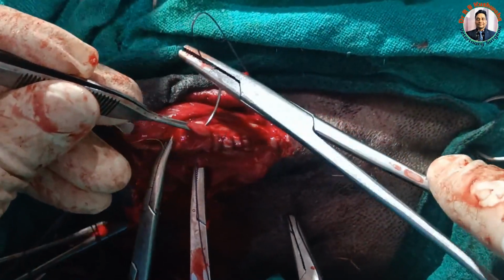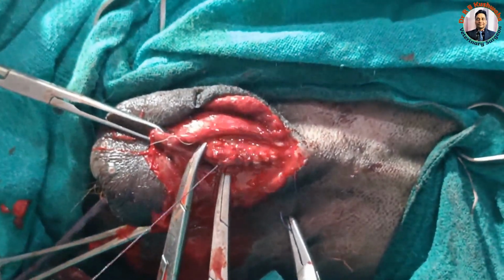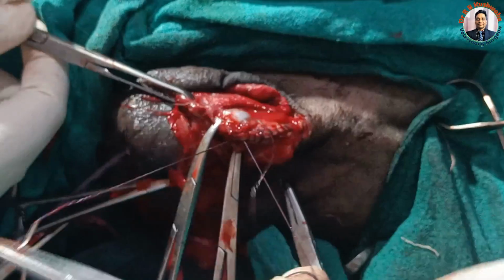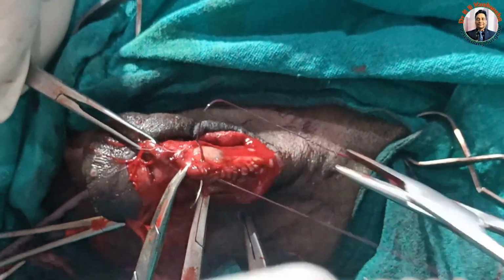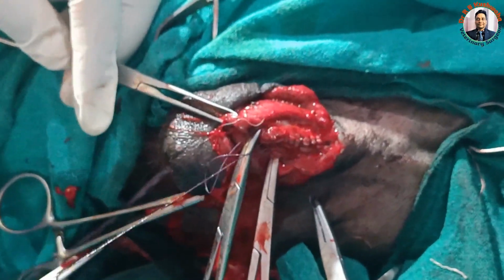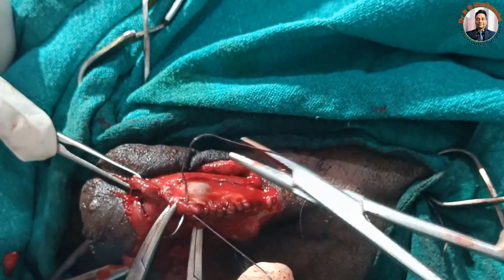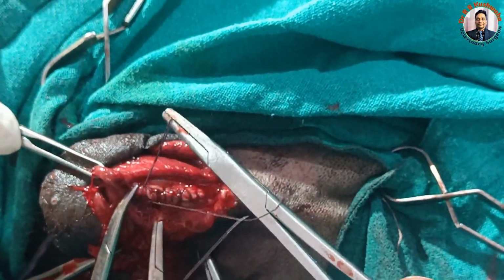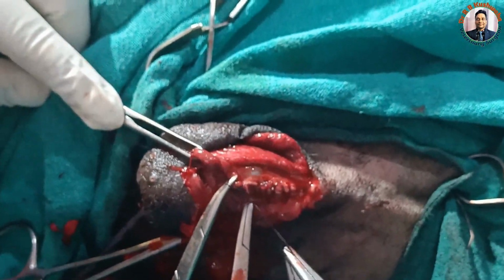So now we are reaching here, almost we have reached up to the anterior commissure of this urethral lumen. Mop it. Cut it.